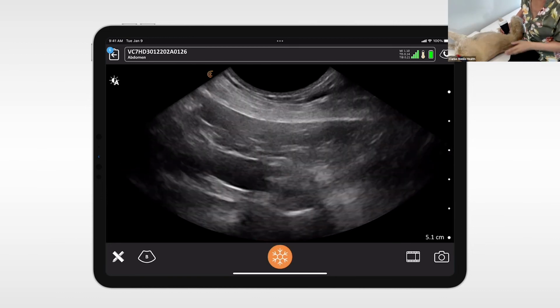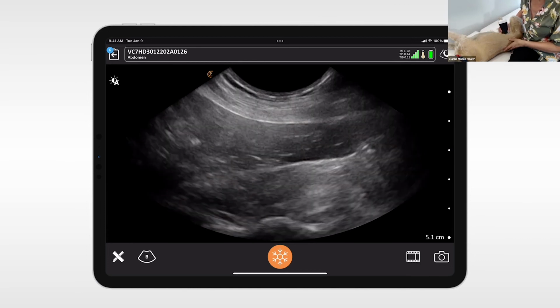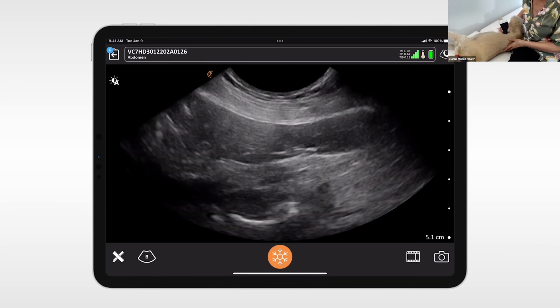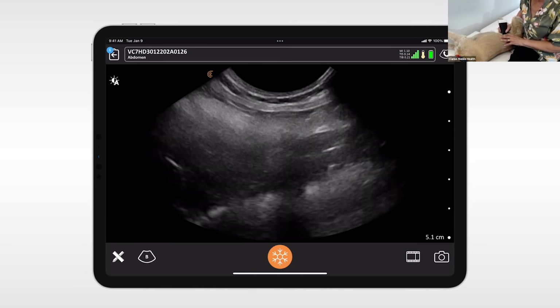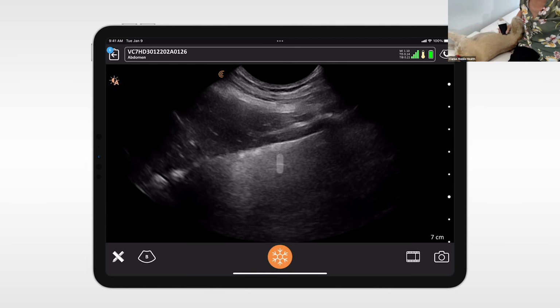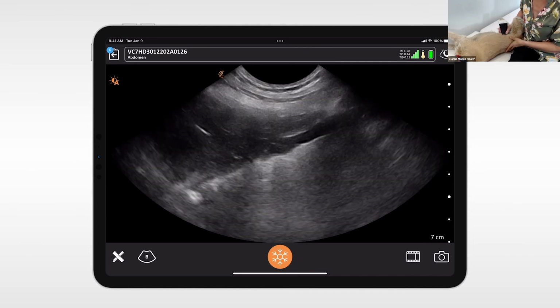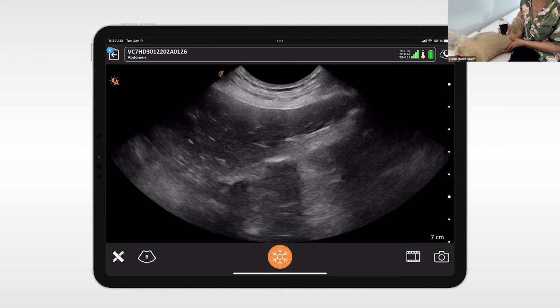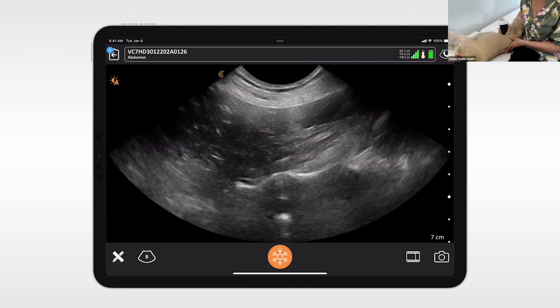All right, now, if I want to find the jejunal nodes, am I in the same area or just a little bit more cranially? Yeah, so what I would do for that is start a little bit more cranial, where the costal arch meets the lumbar musculature. But I would also increase my depth because we may be looking at something that's slightly deeper into the abdomen. A lot of gas there. Slide slowly down the wall of the abdomen to the midline, so going ventrally rather than caudally.